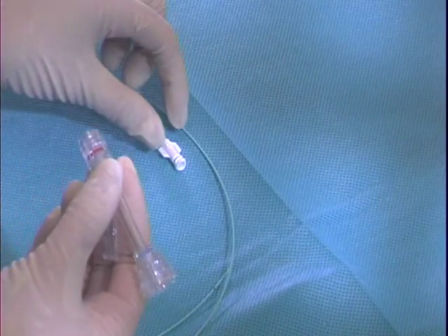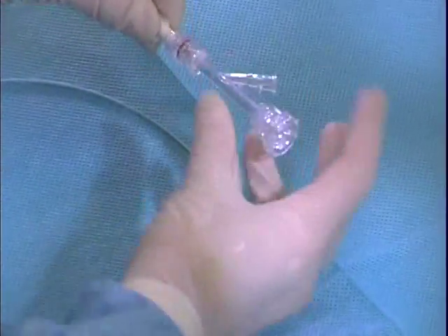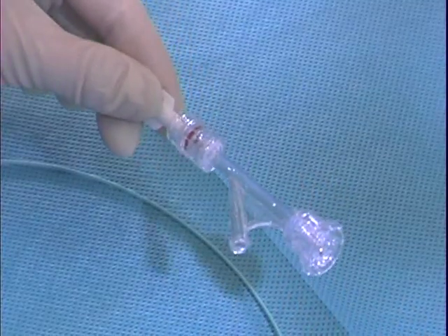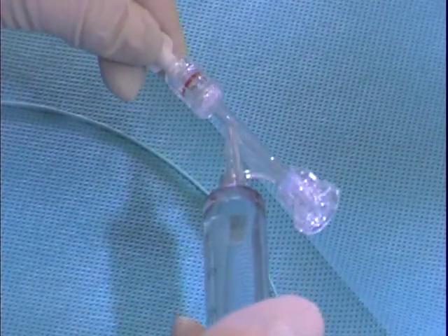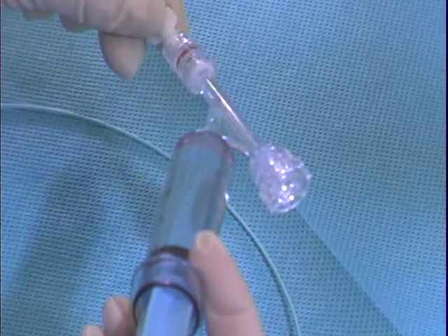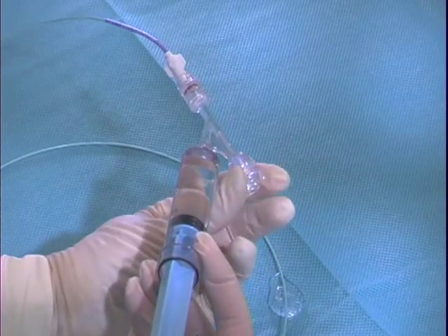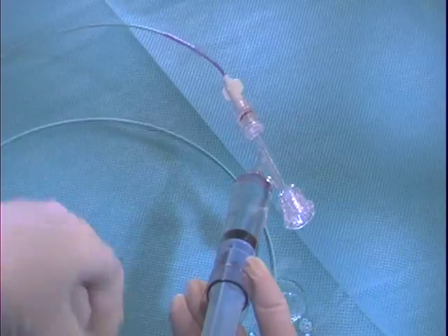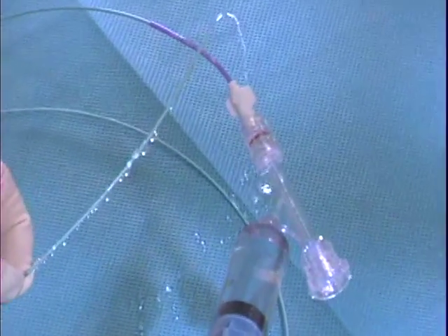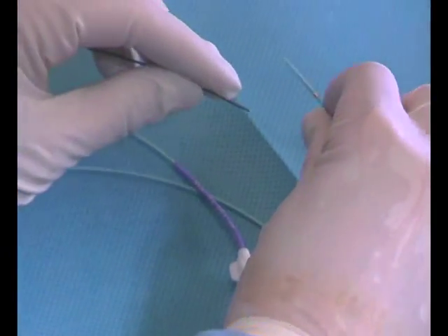Next, attach the hemostasis valve to the Fountain catheter. The hemostasis valve should always be attached to the catheter prior to flushing. To flush the hemostasis valve, attach a syringe to the side port of the valve and gently inject fluid while allowing fluid to fill the entire valve and catheter lumen.